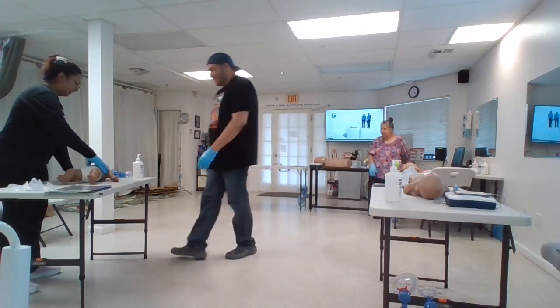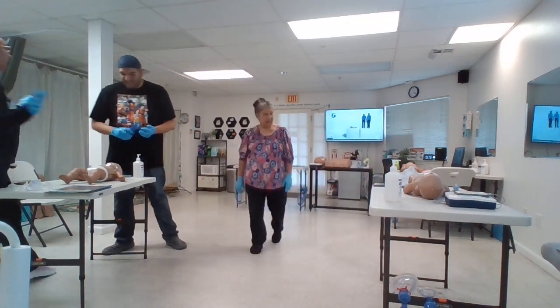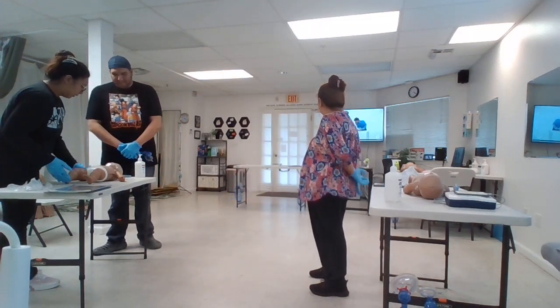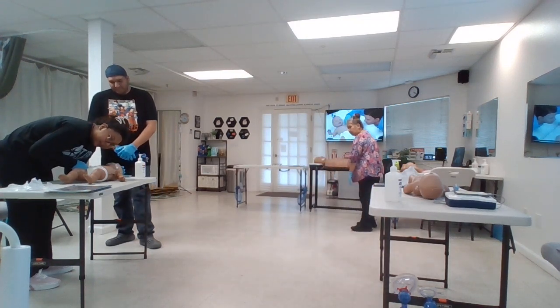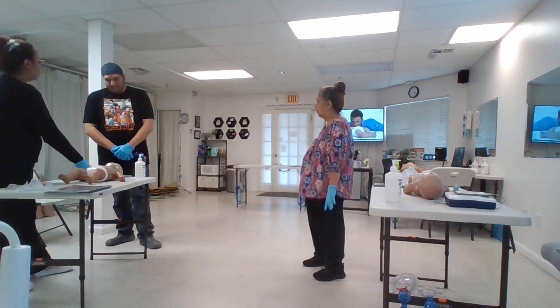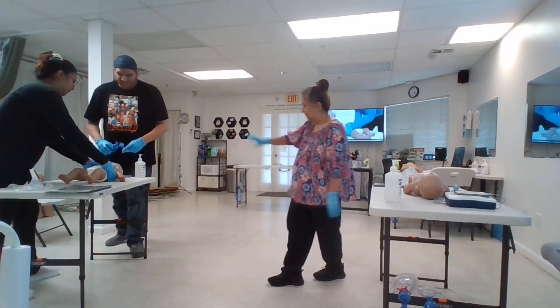Here we go. In 3, 2, 1. Hey, Stevie, hey, are you okay? Are you okay? Activate the emergency response to get an AED. There's no breathing, no pulse.